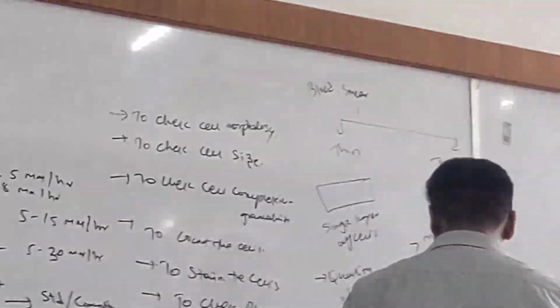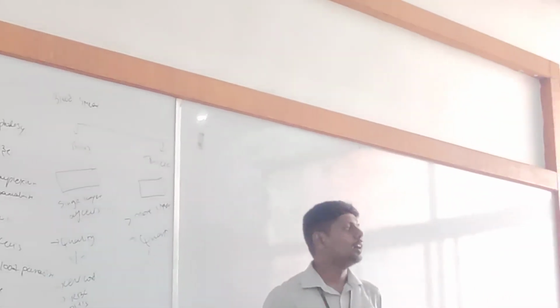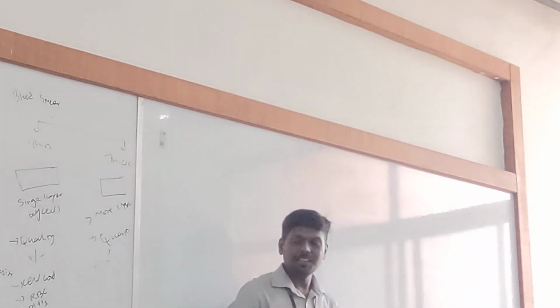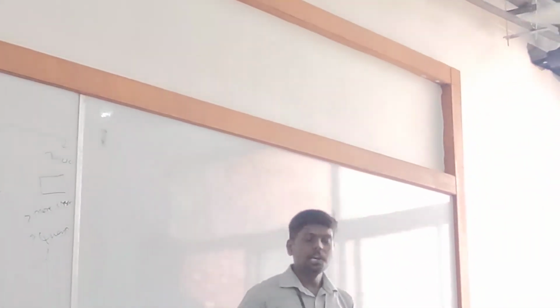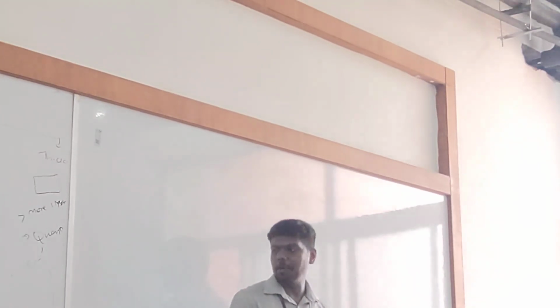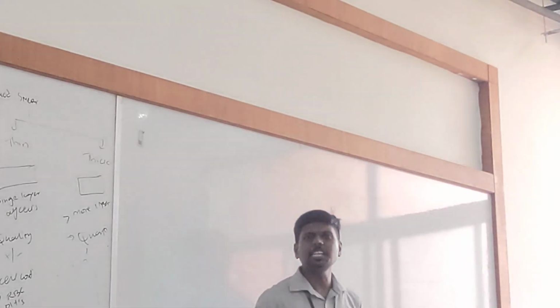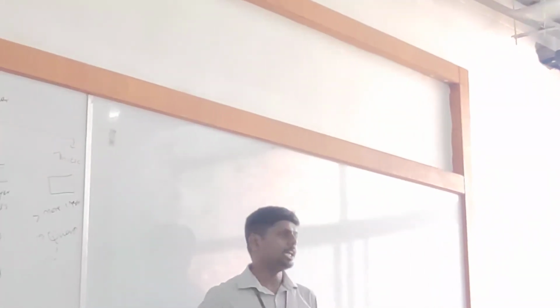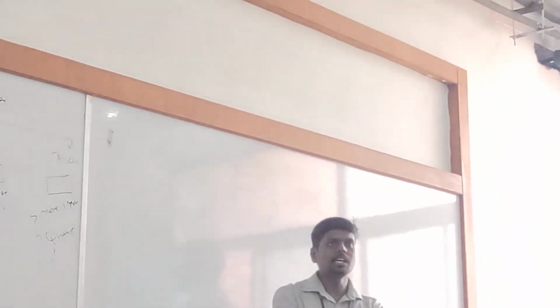Anyway. Coming to the monocytes and lymphocytes. Monocytes have a very large nucleus, whereas lymphocytes are comparatively smaller. I made a mistake. The monocyte has a bean-shaped, kidney-shaped nucleus, whereas in lymphocytes a crescent moon-shaped cytoplasm can be seen. The nucleus almost occupies the cell, and some portion of cytoplasm is visible like a crescent moon. That is the identification feature of lymphocytes. There are two types, small lymphocytes and large lymphocytes. These are the cells of blood.